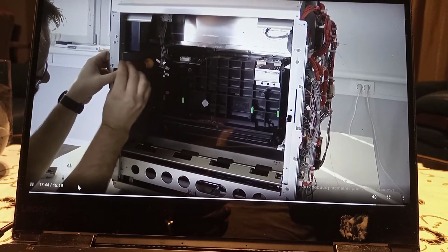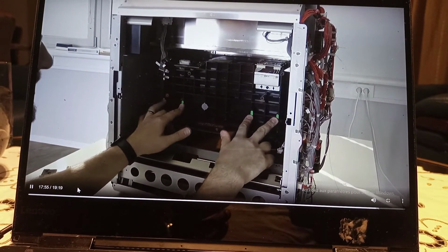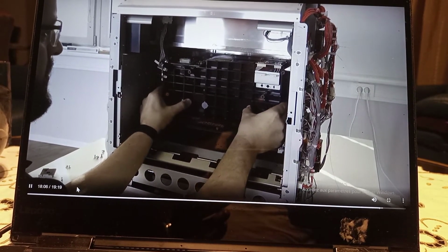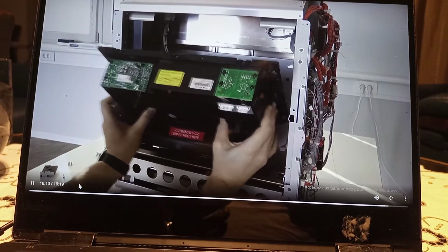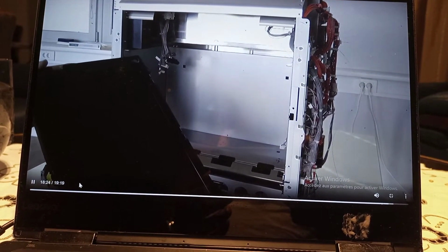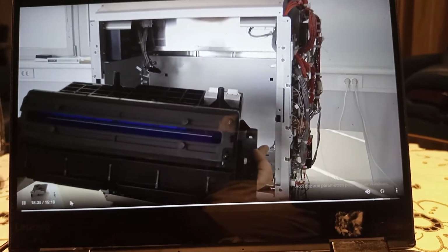And to grab this black box and to remove it, it's recommended to grab it where these green markings are, so like this. So when you are ready and you have loosened all 4 screws, you can grab it here, lift it up a little bit, and remove it like this. So this box is completely closed, and please keep it closed because it's dust proof and it has to be dust proof. There's a small window, so it's also dust proof from the image plate side.